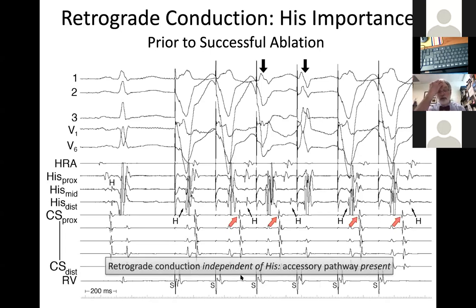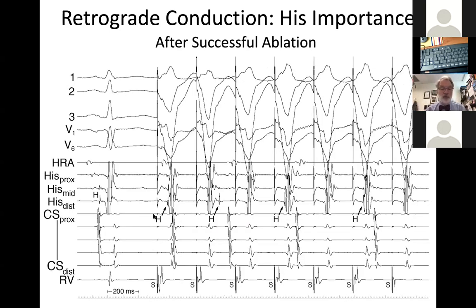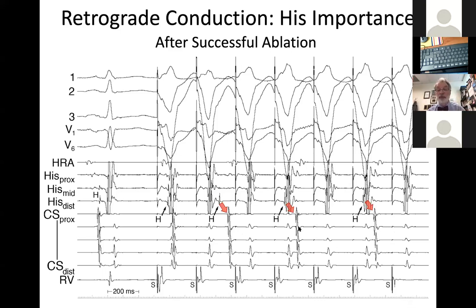After additional ablation, repeat burst pacing shows: a sinus complex first, then a His out the back followed by an A, another His before the local V with an A following, then His appearing with 2:1 retrograde conduction up the His-Purkinje system. Now atrial activation is dependent on the His—meaning conduction is going up the AV node. The accessory pathway has been successfully ablated.